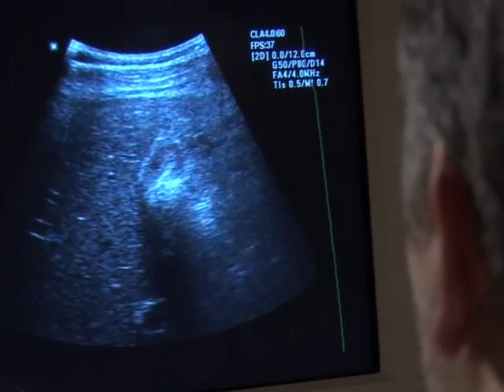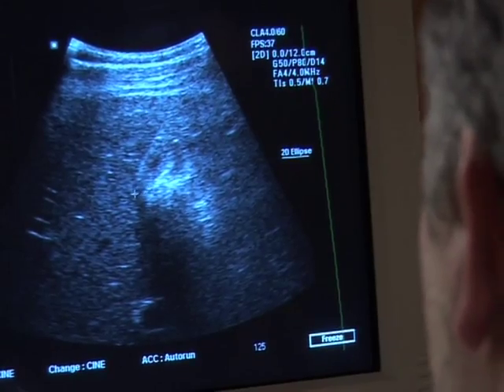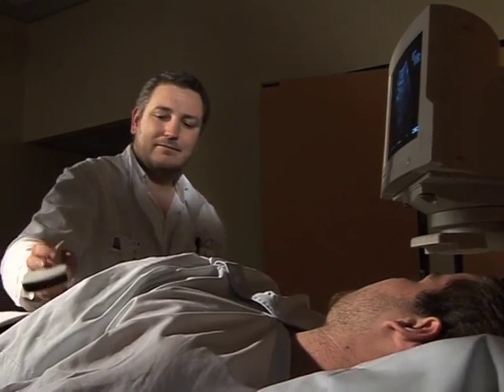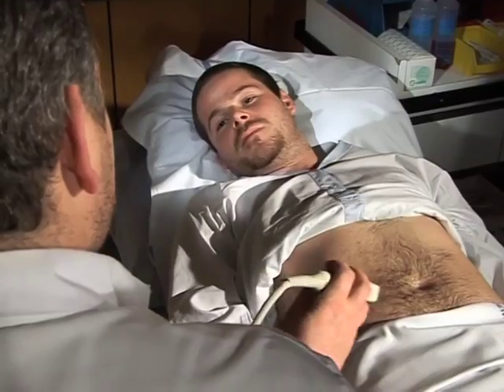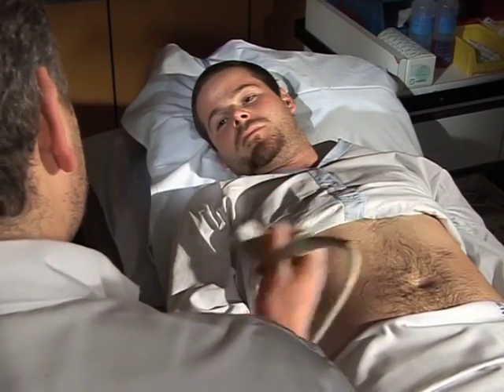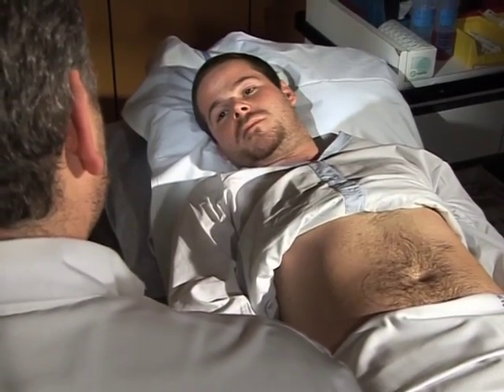Take a deep breath. Hold your breath. And now breathe out. Great. I'm going to prepare my report and send it to your doctor, who will then explain to you the kind of treatment you need.